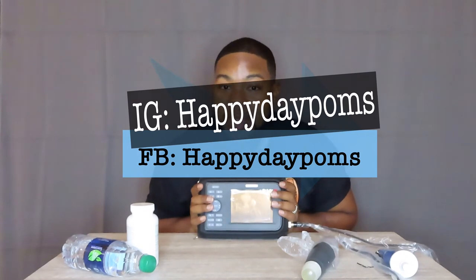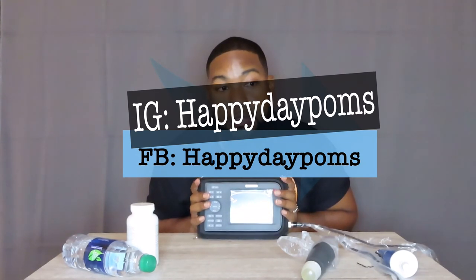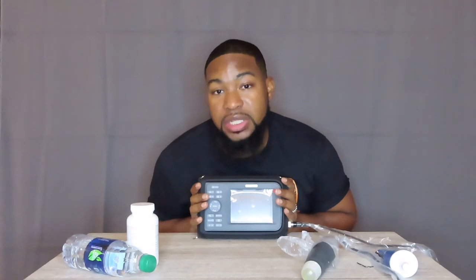I wish that somebody had a video like this when I first got the machine, because I was just completely lost and discouraged because I couldn't see the pups at 30 days. So again, if you have small dogs, you're not going to most likely see them at 30 days. You might see a structure of an embryo, maybe like a cloudy something, but you're not going to have 100% confirmation on pregnancy until she's about 35 days, 34, 35 days.